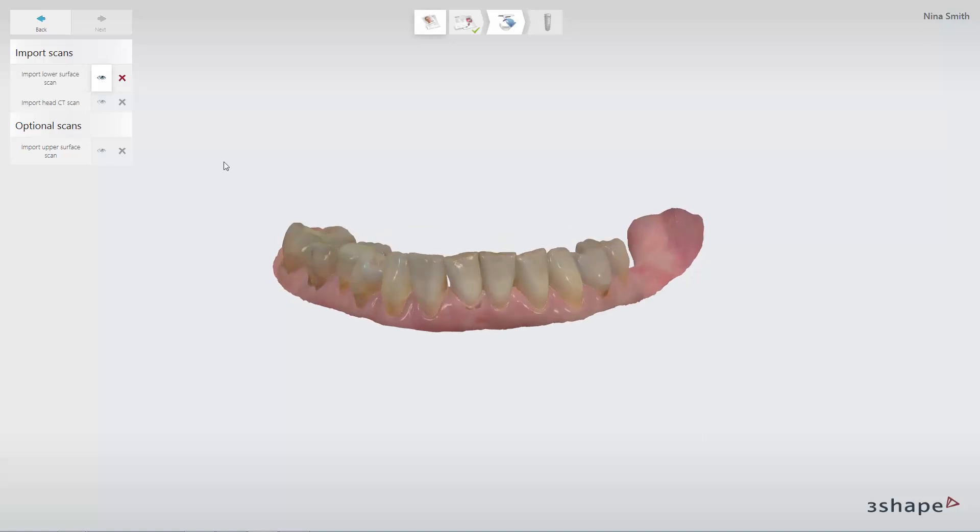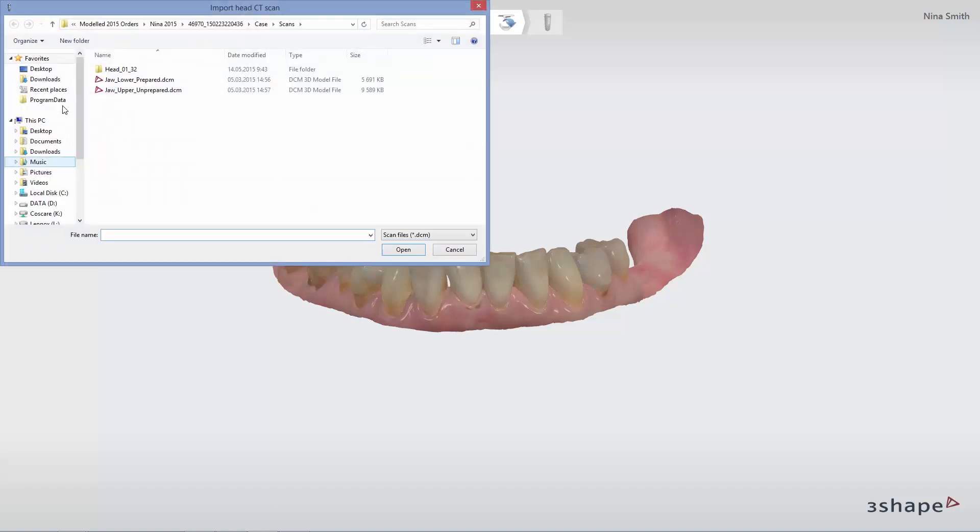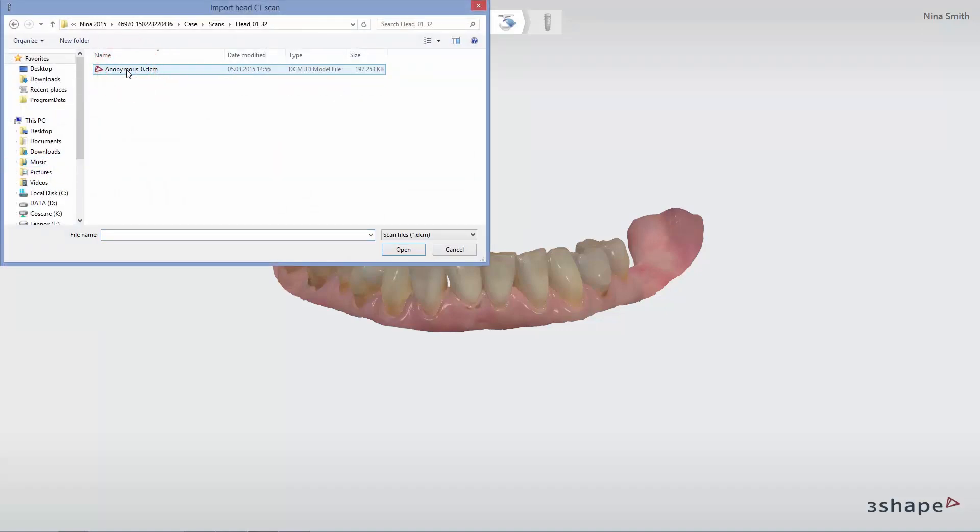To import a CT scan, click Import Head CT Scan and find the correct DICOM file. Double-click any of the files or click Open when any of the files are marked.